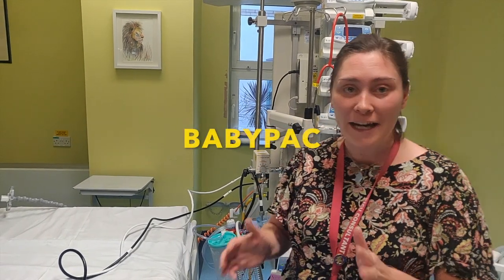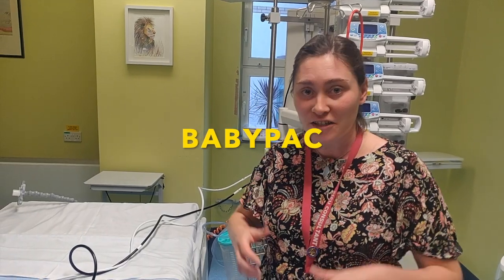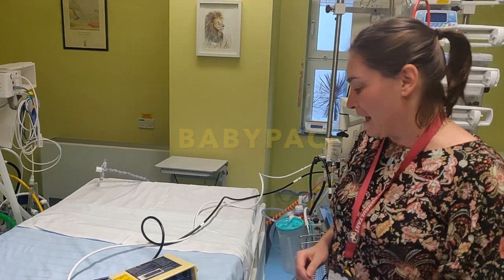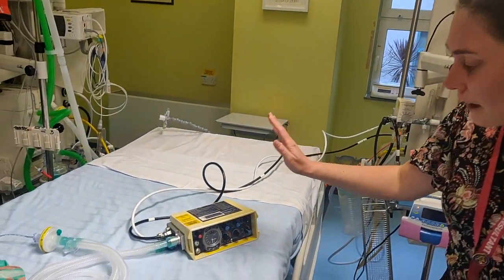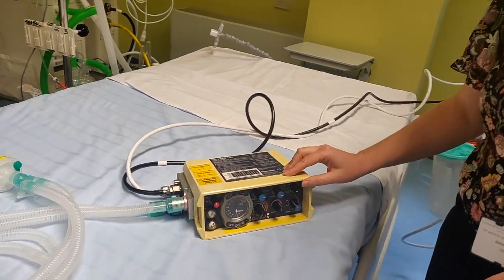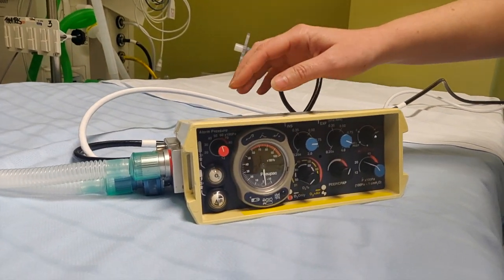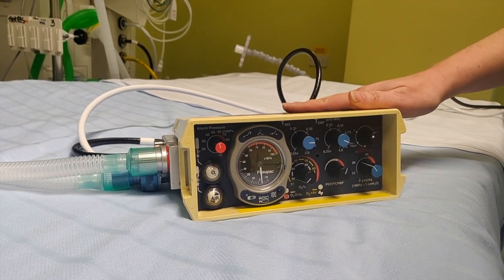Hello again. Here, 15 minutes before starting my shift with the hair already up ready for my patients. I'm going to go through the baby pack because there was a request that we review this ventilator, as a lot of peripheral hospitals use it.